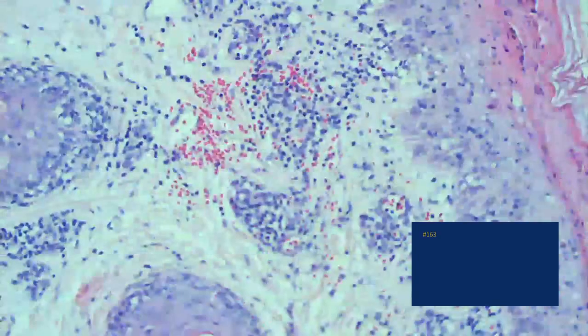So, nice example. And the scale of this, it's a scale crust. It's a wafer-like crusted cornified layer. It's adherent. It's not branny like you see with something like tinea versicolor. This is an adherent scale crust. I think we got a couple of pictures of this too.